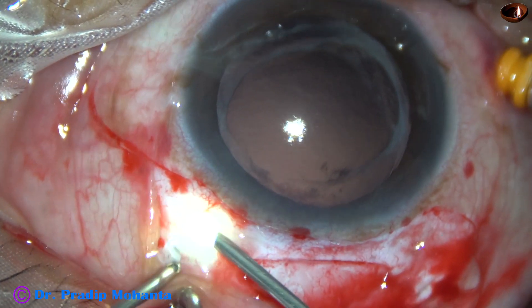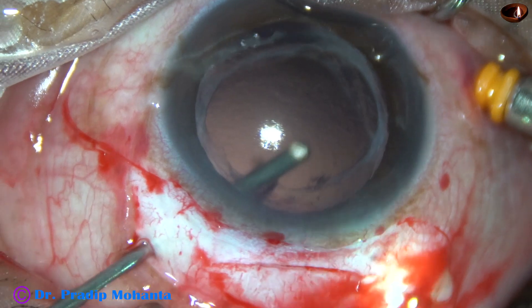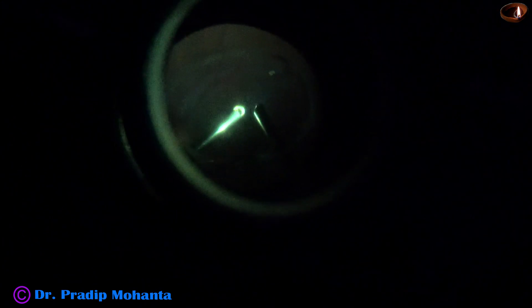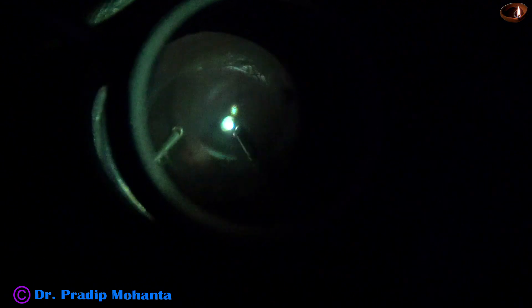We have to find the other sclerotomy. The light pipe goes through the right sclerotomy. An irrigating contact lens is placed over the cornea, which neutralizes the dioptric strength of the cornea. We can see the central retina, and we can see that the intraocular lens has dropped posteriorly.